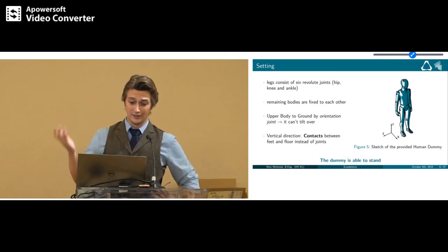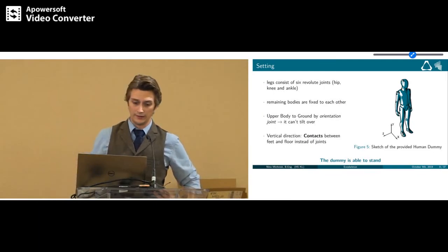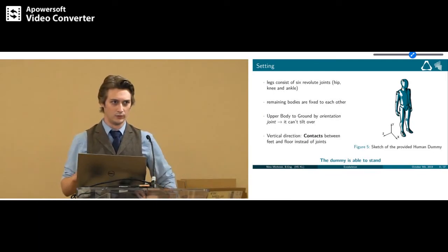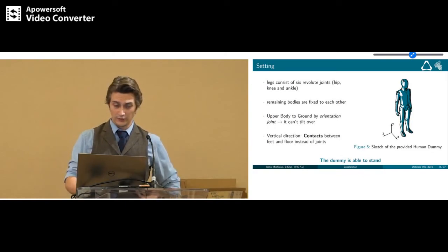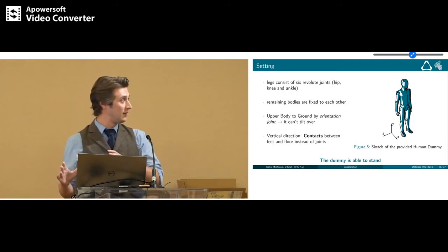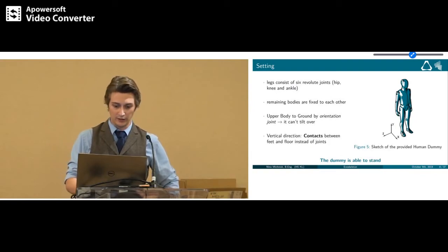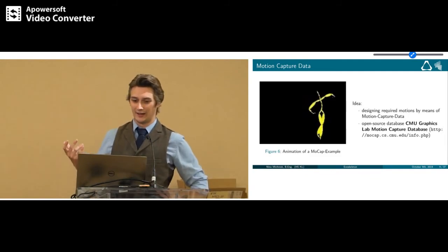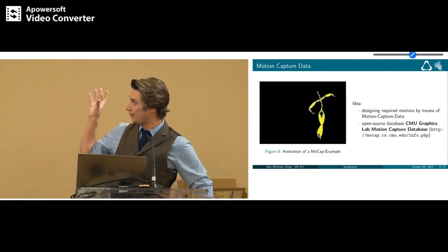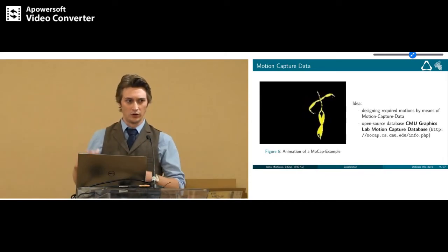And though I didn't want it to fall upwards, I've added a floor and basically used contact between the feet and the floor so it doesn't fall in the direction of gravitational acceleration. So when I now put all the rotational angular velocities in the joints to 0, the dummy was able to stand. But standing wasn't a task which I had to achieve, so I've used motion capture data. This was the basic idea to get some motions into it.